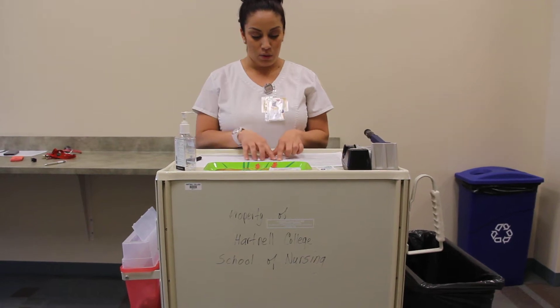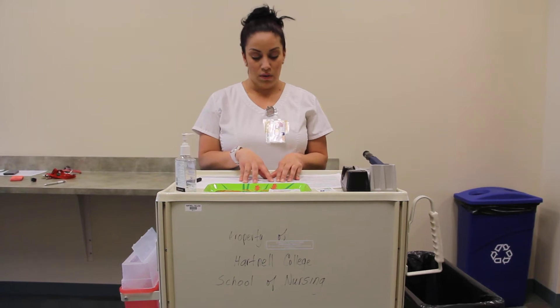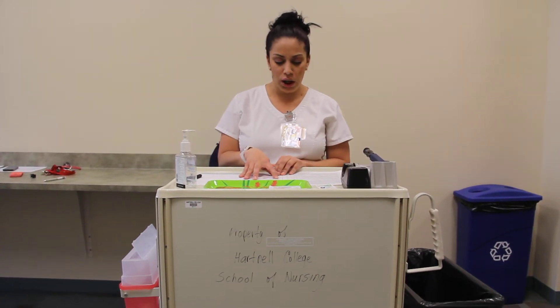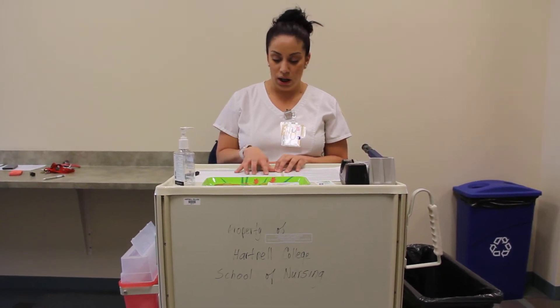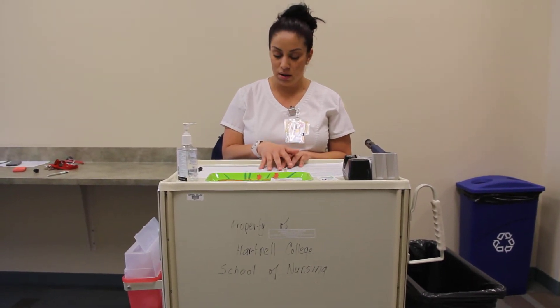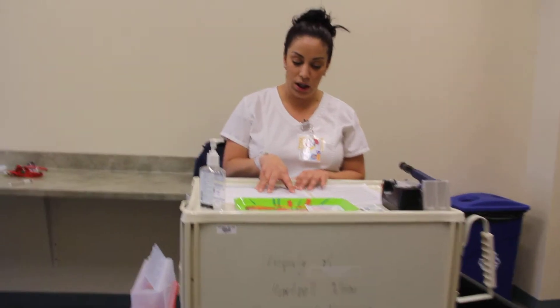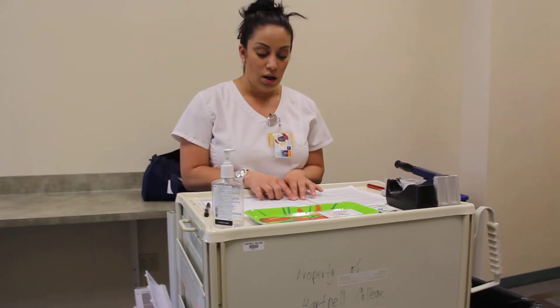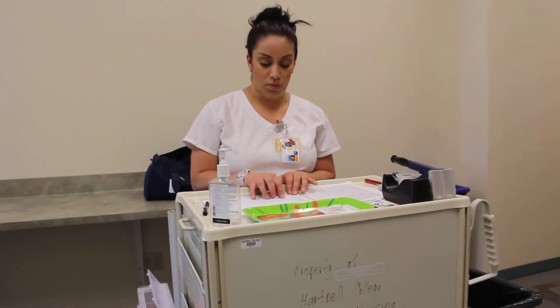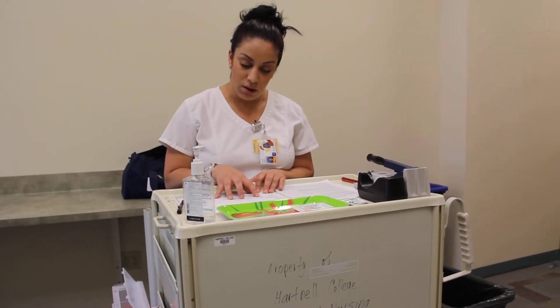I am going to be administering two insulins: NPH and Novolin R. For the Novolin R, I just checked her blood glucose and her blood glucose level was 121, so I'm going to administer three units. That's the right dose. Right route is going to be sub-Q at 900.